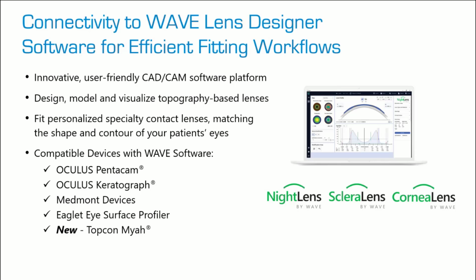The Wave software allows users to design a full range of GP lenses, so that includes our night lens, which we'll talk about in this presentation, and it also supports scan-based custom designs for cornea lens, which is a traditional GP. And in addition to that, our scleral lens platform delivers great results when we pair that with profilometry for enhanced scleral coverage. We are currently compatible with the devices that you see listed here. And as you know, the TopCon MYAH is the newest addition, and we're very excited to talk more about that.